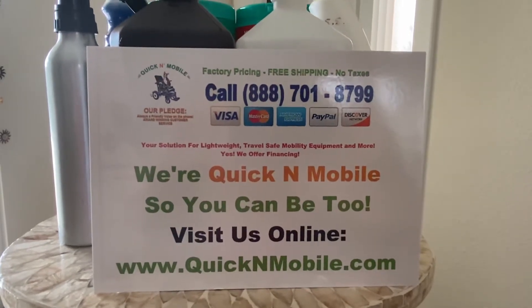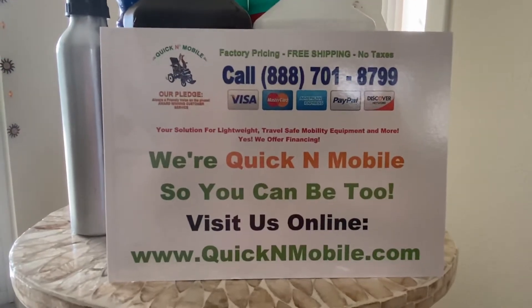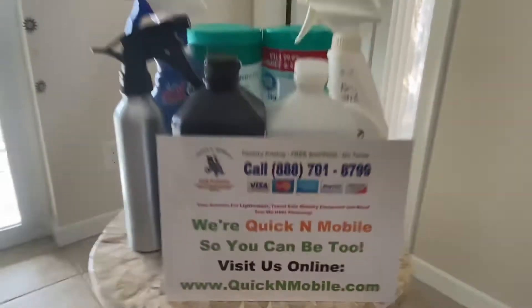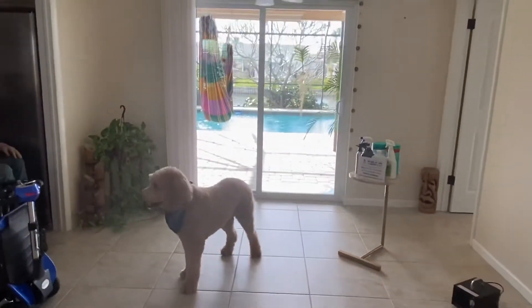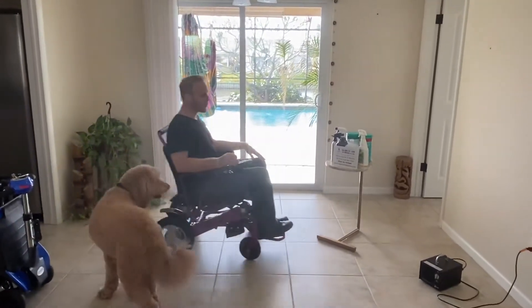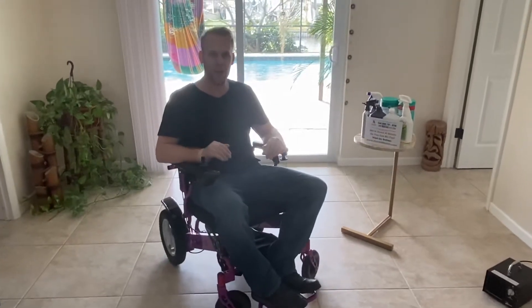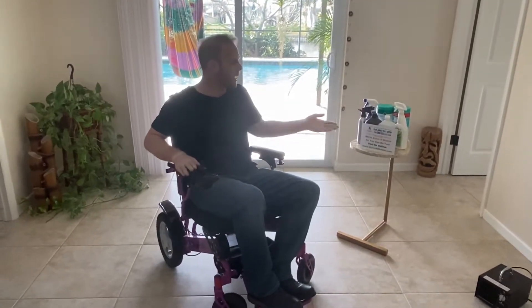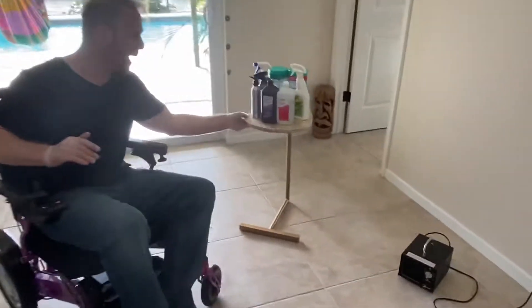Hello and thank you for choosing Quick N Mobile. This video will have helpful hints on how to sanitize and disinfect your power folding wheelchair. This is Paul from QuickNMobile.com, and you can see we have our mascot Toby here as well. We have an Eagle power folding wheelchair and a whole table full of cleaning supplies.